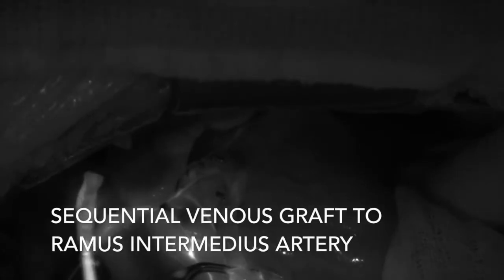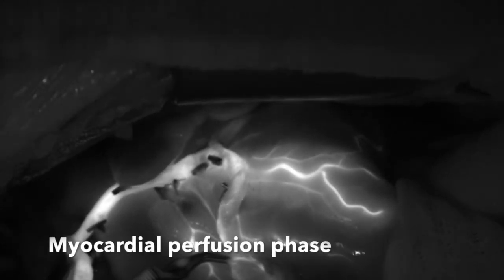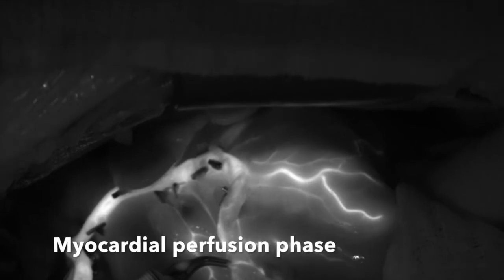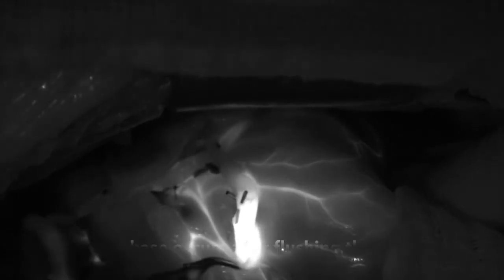These next images demonstrate a vein graft to a ramus branch. We look at the distal and look for three phases during the study. The most important phase is the arterial phase to ensure patency of the graft. The second phase is the myocardial blush phase. Some researchers have attempted to quantify the myocardial perfusion of the heart based on the time to peak intensity of the pixels and the maximum pixel intensity, although this is not entirely quantifiable — qualitative assessments can be done. The final phase is the venous phase, where the veins illuminate, typically after flushing with saline.